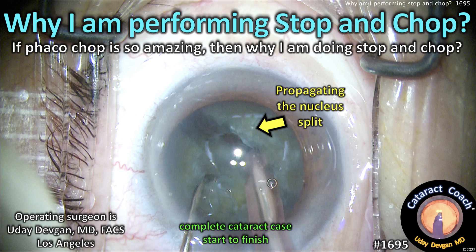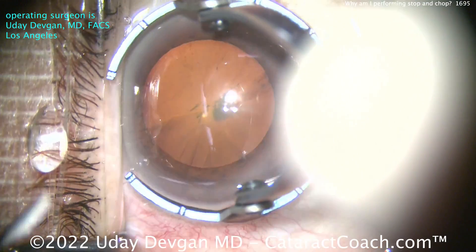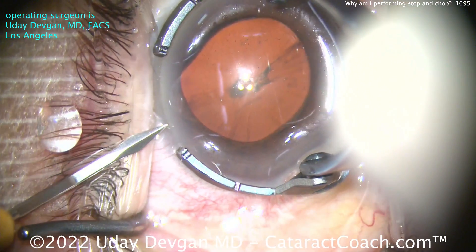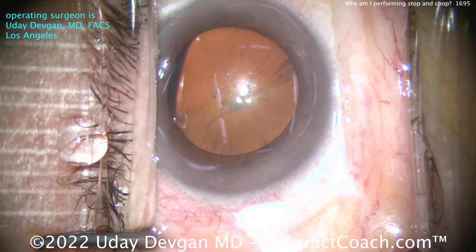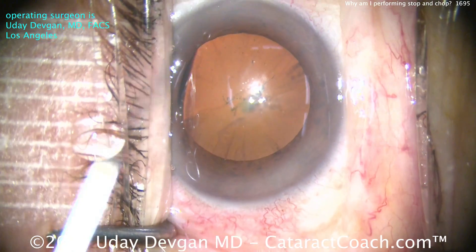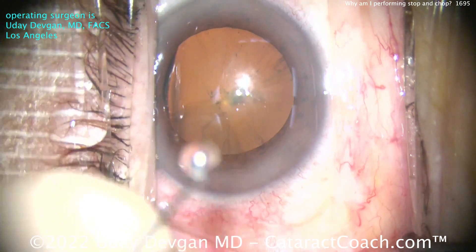CataractCoach.com. Why am I performing stop and chop? If phaco chop is so amazing, then why do stop and chop? Hey, Cataract Coach, I got a question for you. You're always talking about phaco chop this and phaco chop that, but how come there are some cases where you still perform stop and chop? What's up with that?